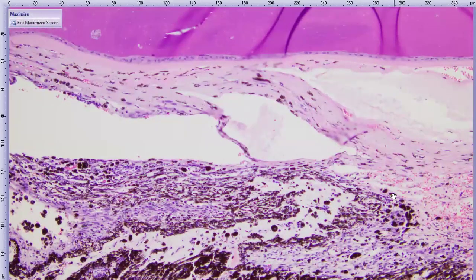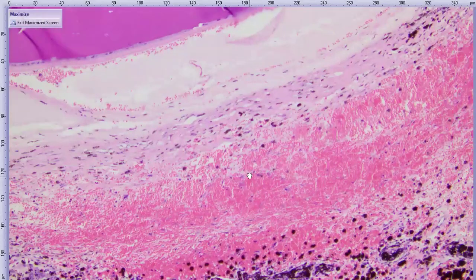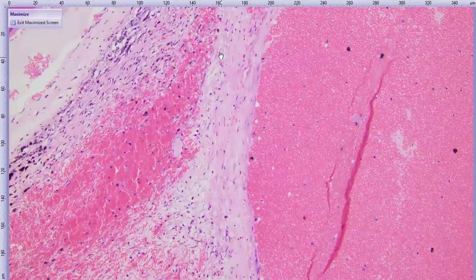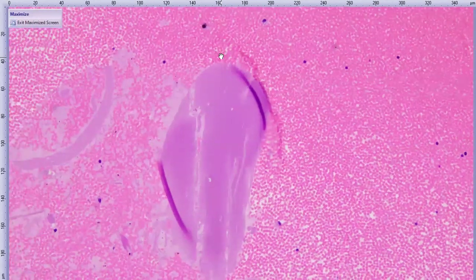There's a little bit of inflammation in the uveal tract, some lymphocytes, plasma cells. Again, lots of hemorrhage. We can see our liquefaction of our lens fibers here. There's also evidence of intralenticular hemorrhage. So again, discontinuous lens capsule, letting the hemorrhage in. And if we look at some of this purple stuff back here, it looks very similar to our lens material. So we've got free lens fibers also in the subretinal space along with this hemorrhage, just corroborating our lens capsule rupture.